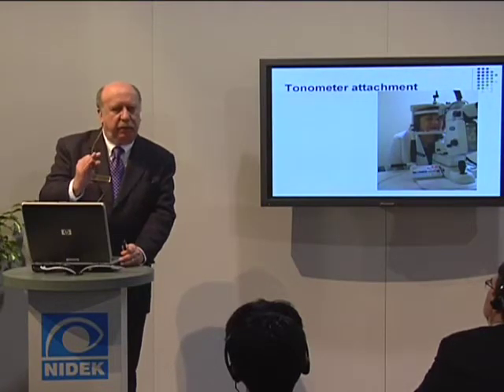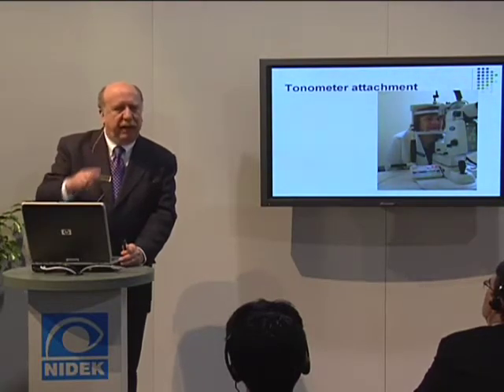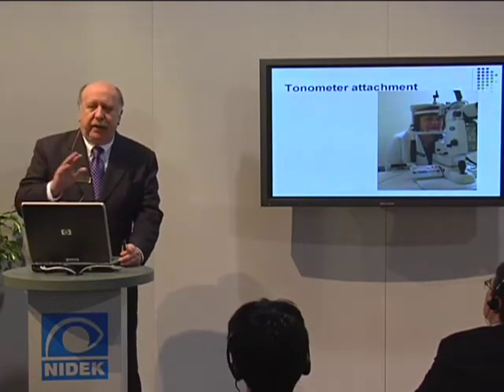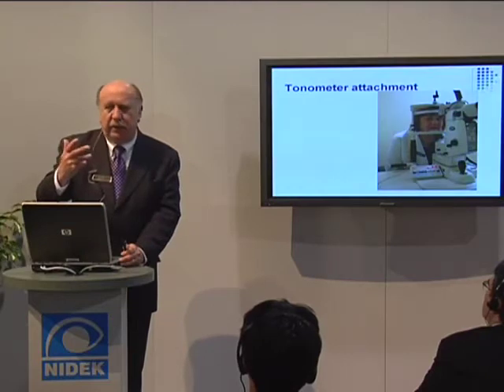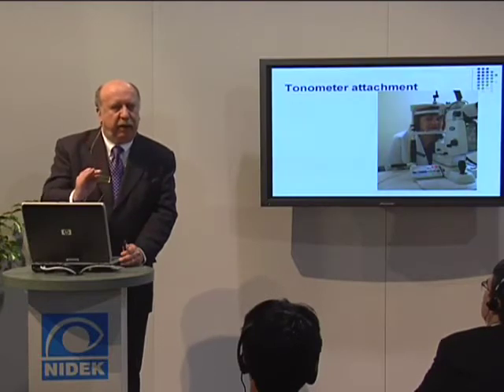The actual laser beam goes from a round to an oblong shape, and so your power density is then affected, and your treatment parameters are affected. So what you want to do as a physician, when it comes to YAG lasers or even photocoagulation, it's all about good imaging. It's all about good visualization of your target tissue. So if you can reduce the reflections, keep your laser beam round, and so forth and so on.